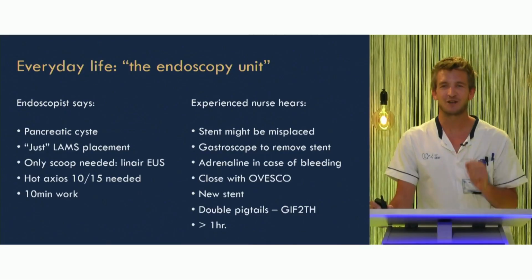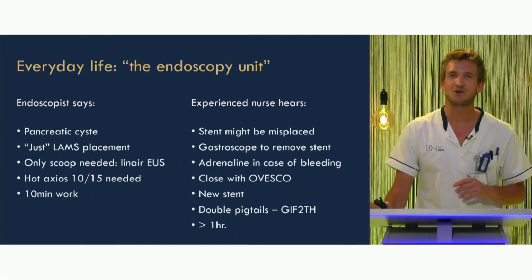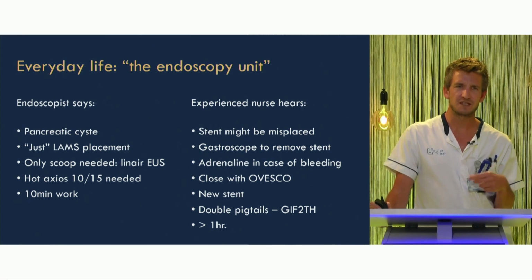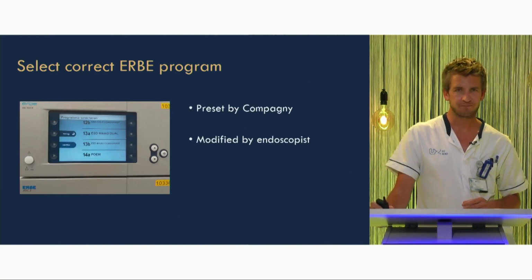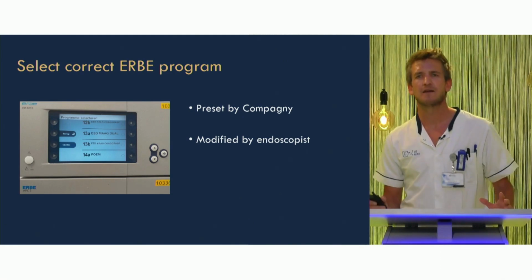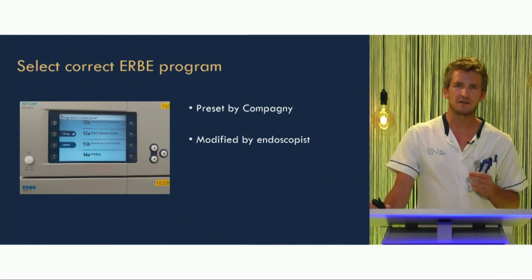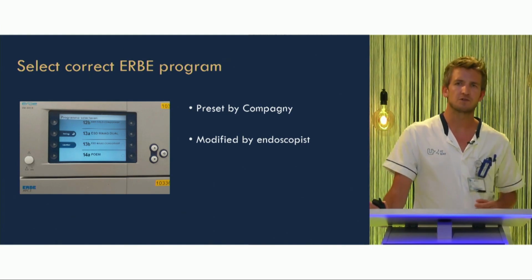So it's just an example. It's not like we misplace stents all the time, but I will just say that when you discuss your procedure with the doctor and nurse together, you can avoid this kind of surprise. You still have to select your correct ERBE program. Most of them are preset by the company, but the endoscopist can still modify the program during the procedure, depending on how it goes.